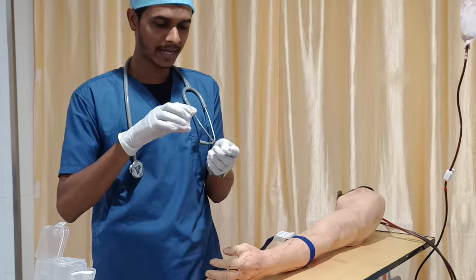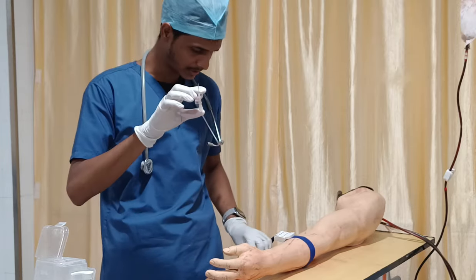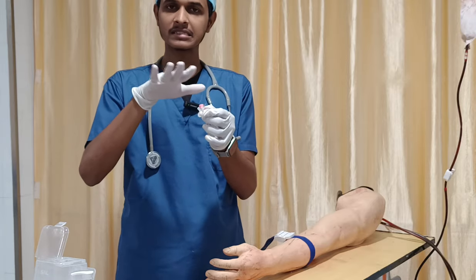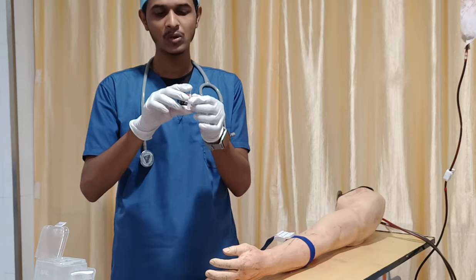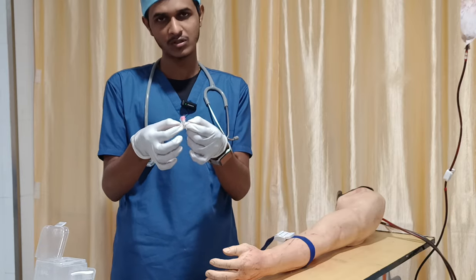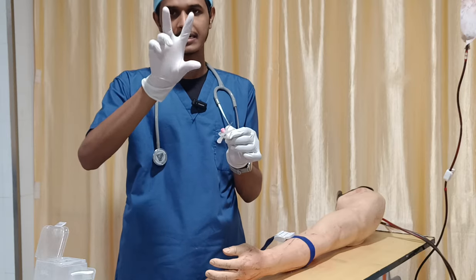Once you take out the cannula from the protective cover, you should not touch this plastic portion. It is completely sterile. You have to spread the butterfly wings out, and then place your cannula in a triangle manner.